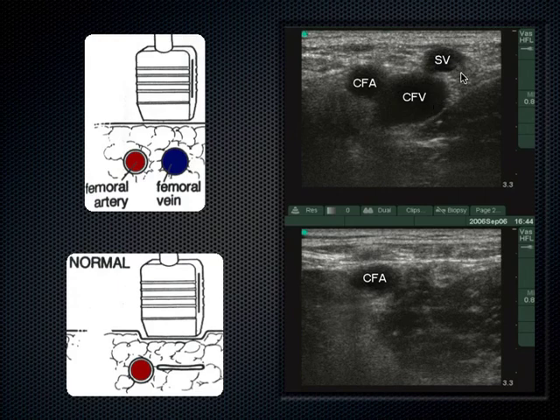SV, what do you suppose that stands for? Saphenous vein. It's a superficial vein very close to the skin line. So we're pretty up high in the groin. We're very superior when we start doing this, okay? Right where the confluence of the saphenous comes in, I mean, you're really like right up in that inguinal area where you start this test.